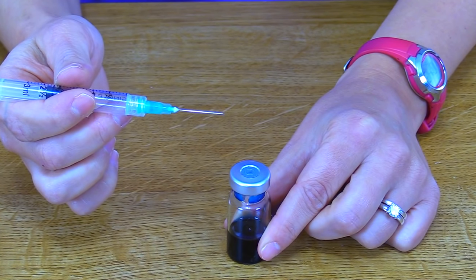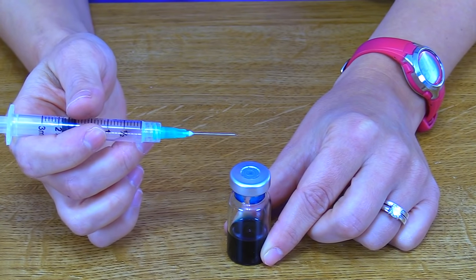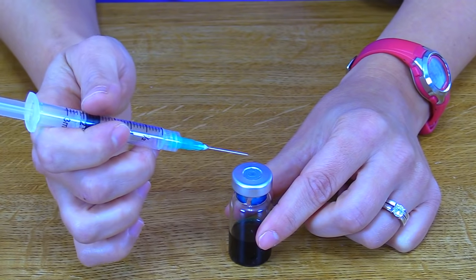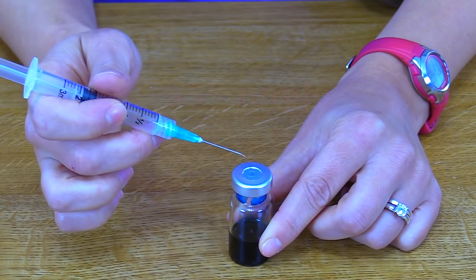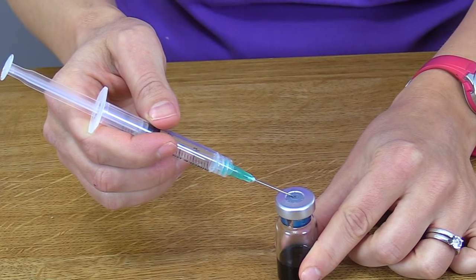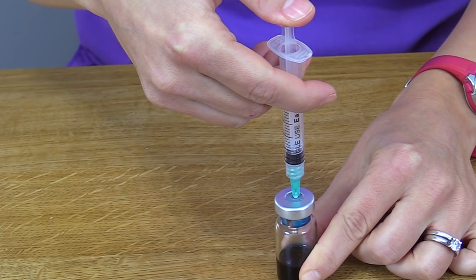Whenever you're using a needle to pierce the top of a rubber stopper, you want to use a technique that prevents coring. Coring occurs when parts of the rubber stopper enter into the vial and contaminate it — possibly being injected into the patient. Most vial stoppers have a bullseye-type design, and you want to go in the center of the bullseye. Position the needle at the center of the bullseye at a 45-degree angle with the bevel of the needle up, facing you. Apply pressure to the tip, and as the needle begins to penetrate the stopper, push down while simultaneously rotating the needle to a 90-degree angle in one smooth motion. Then inject the air into the airspace of the vial.